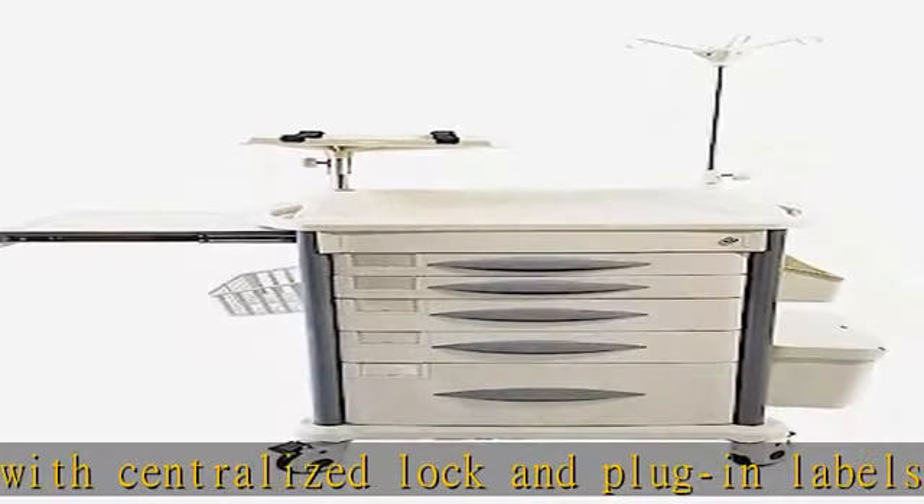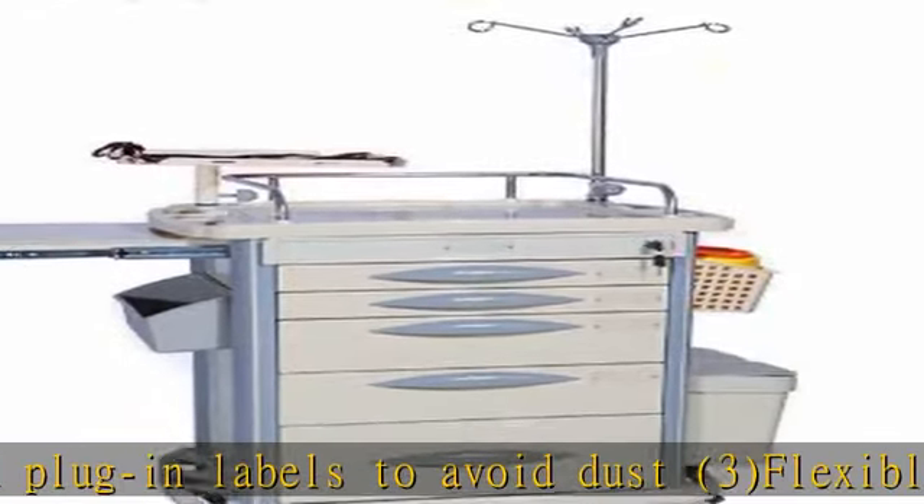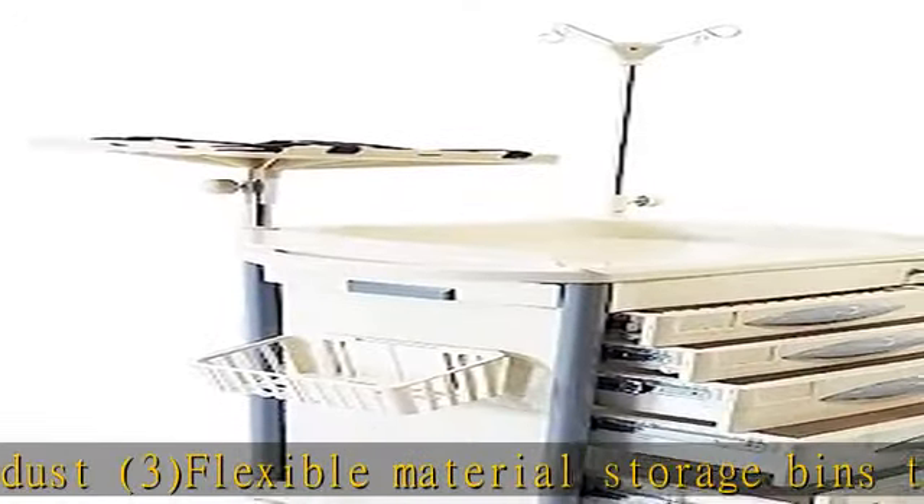2 locking casters designed to eliminate debris from wrapping the caster. Drawer dividers for arbitrary partitioning, 2 trash bins, telescoping 4-pole, defibrillator shelf, CPR board, oxygen tank holder, and folder.